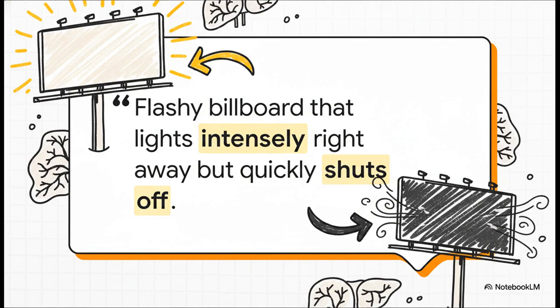It lights up, boom, super intense, grabs all your attention. But then, it just shuts right off, leaving darkness. That big flash, that's the arterial hyperenhancement. And that sudden shut-off, that's the signature move, rapid washout.